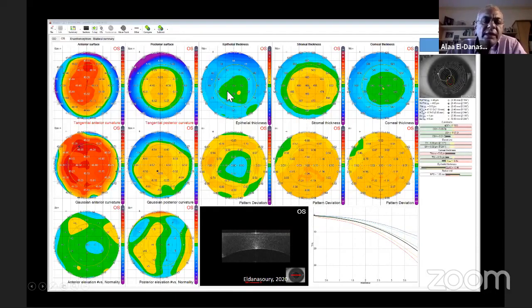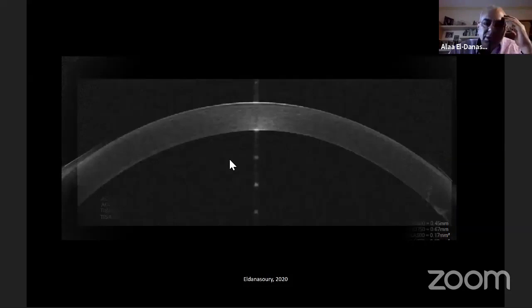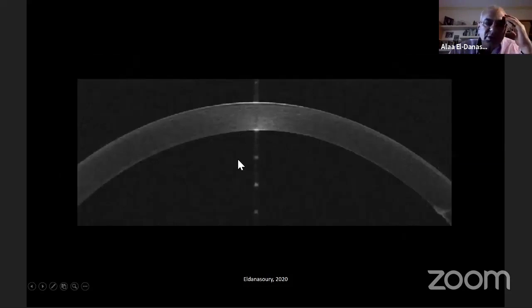Also, having the anterior segment OCT with good resolution, you can look at the angle, at scleral spur, as Erik just mentioned before. You can even see the wound of your cataract surgery. If you want to look specifically on the cornea, like in corneal dystrophies or degeneration, then you have high resolution corneal images. And this is the applanated cornea. As I mentioned, you can see the epithelium very clearly, the Bowman's layer, and you can also see the posterior surface if it shows a little bit of asymmetry like in this case.